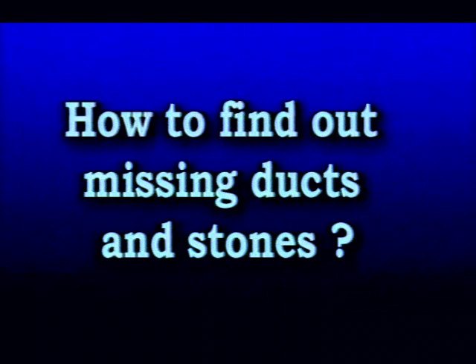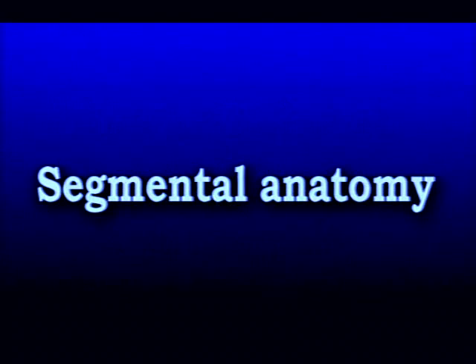Now, I am going to talk about how to find out missing duct or stones. Understanding of segmental anatomy of intrahepatic duct is very important for the removal of intrahepatic stones. Intrahepatic stones frequently accompany multiple strictures, and because of this stricture, a problem of missing duct can happen.